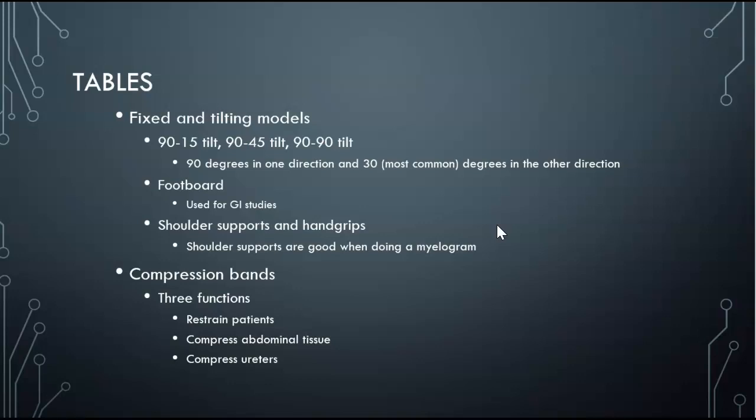We're not supposed to restrain patients with our compression bands. If you're by yourself at 3 in the morning and the person has seizures, you're going to want to use a compression band to help keep them from falling off the table. The thing is, it's false imprisonment, so they have to be able to get out of it.